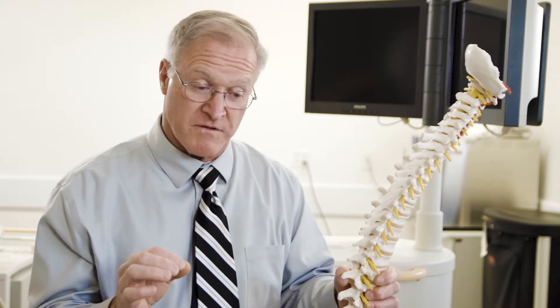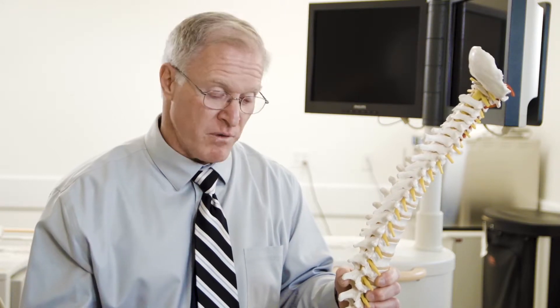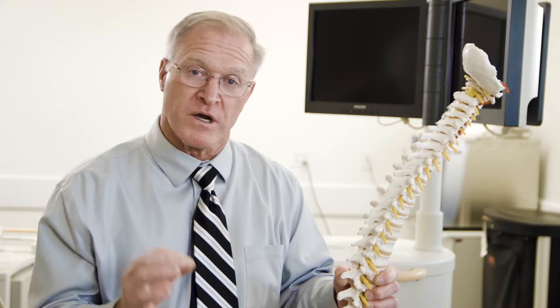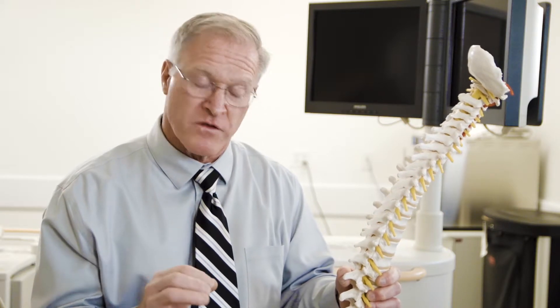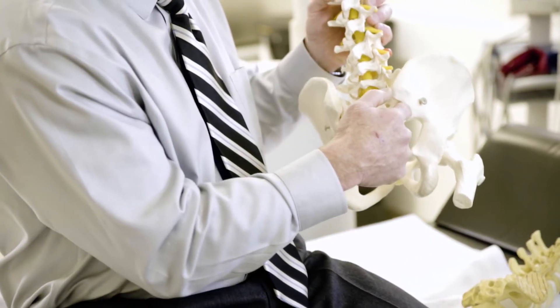We'll clean off your back and give you a very small numbing shot with a 27 gauge needle — sometimes people really don't feel that part. Once the skin is numb, we're going to advance another needle down into the joint itself.